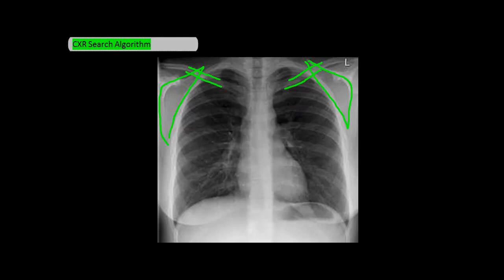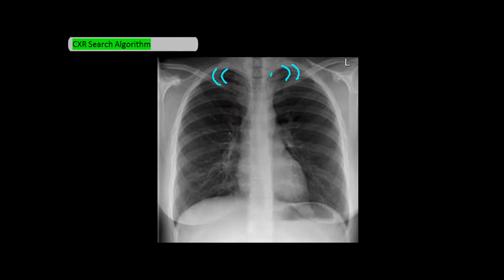I want to talk a little about counting ribs, because it's something people don't realize they do poorly. The first rib is actually here — that's the first rib on the left side, and the first rib on the right side looks like this. I know it may not look like it, but it is the first rib. The second rib is here, and I'm outlining its borders on both sides. So if you want to count ribs: you have one on both sides, and two on both sides.